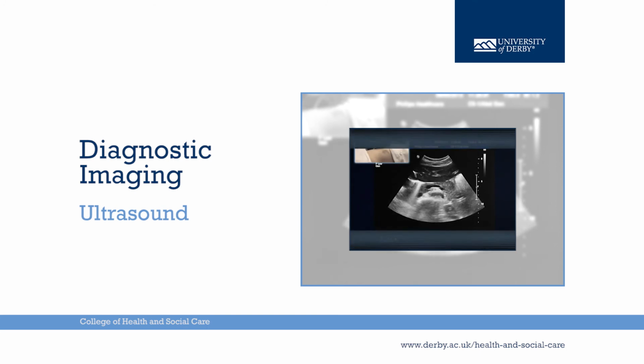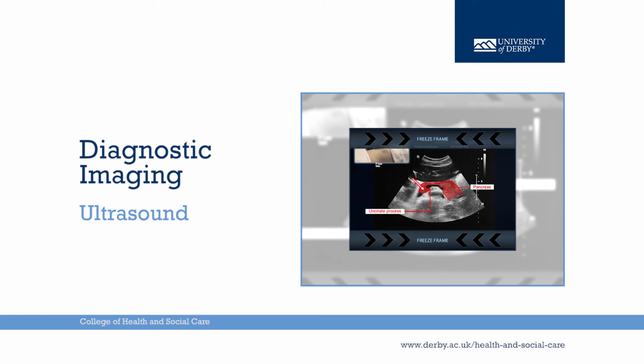Slight rotational adjustments to the right helps to image the head of pancreas and in some cases the uncinate process. To the left will enable visualization of the tail. The portal confluence is seen posterior to the head, with the splenic vein seen posterior to the length of the body. These form a characteristic tadpole appearance.